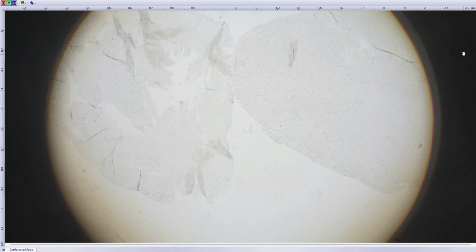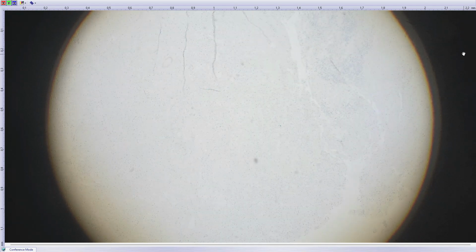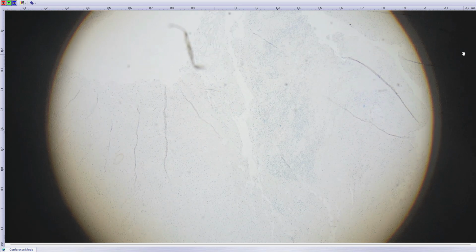But in our series of cases, GPNMB showed better sensitivity compared to TTF1, and in fact, in this case, there was no TTF1 positivity, so I find this GPNMB antibody quite useful. So: subependymal giant cell astrocytoma in a patient with tuberous sclerosis complex.